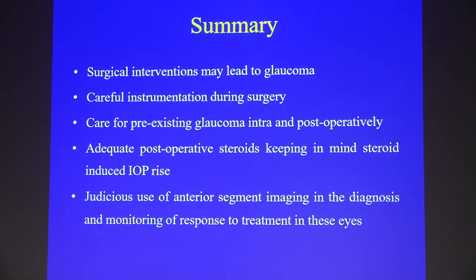In summary, surgical intervention may lead to glaucoma. Careful instrumentation during surgery is very important. Care for pre-existing glaucoma, intra- and post-operatively, is mandatory. Adequate post-operative steroids, keeping in mind steroid-induced intraocular pressure rise, and judicious use of anterior segment imaging in the diagnosis and monitoring of response to treatment in these eyes.